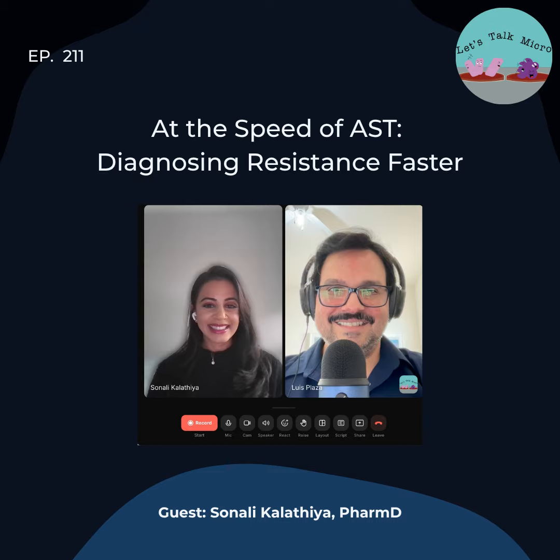Yeah, so I think the clinical data in specific patient populations, we're still learning a lot. However, it's thought that there might be particular benefit in, again, sepsis or critically ill patients, as I mentioned earlier, patients with multi-drug resistant infections.